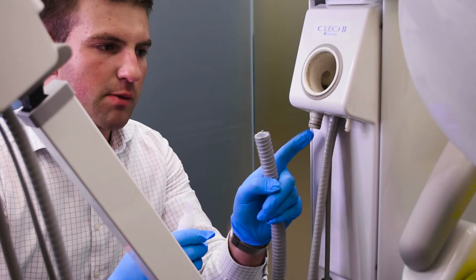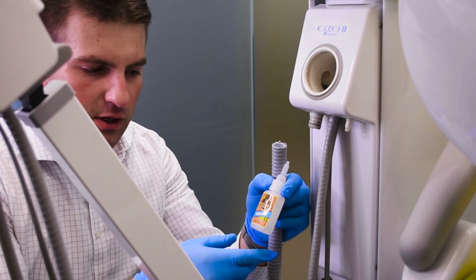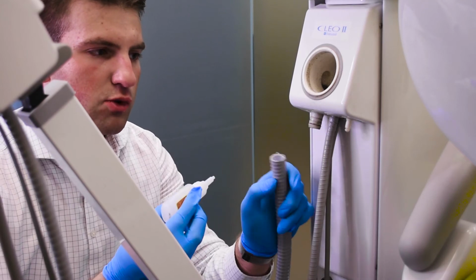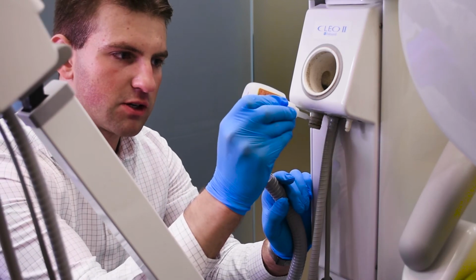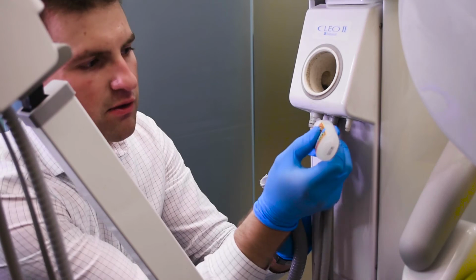So the suction hose should be applied to a dry surface using glue. In this case I'm using super glue gel from Gorilla Glue, and it's very important this is dry, and a small dab of glue can go onto the barb. So rather than put it on the hose, I put it on the barb and just apply a couple of dots, maybe 3. Doesn't need to be very much at all.